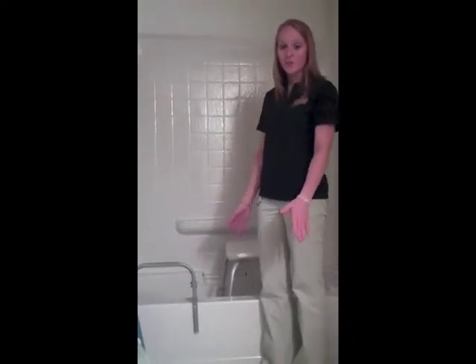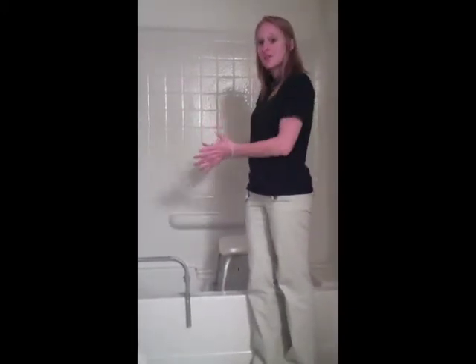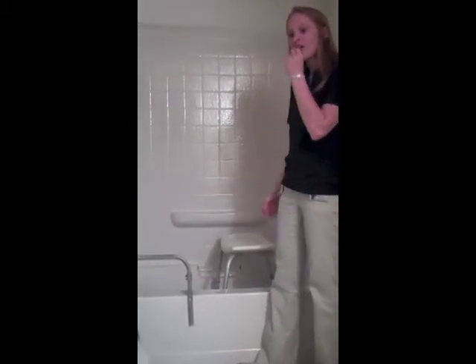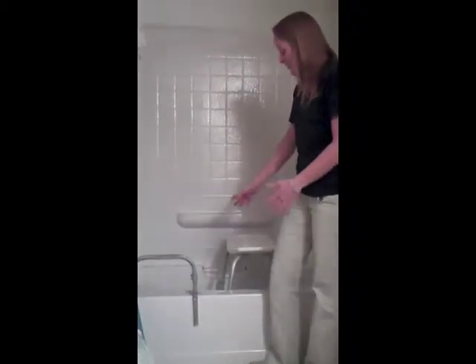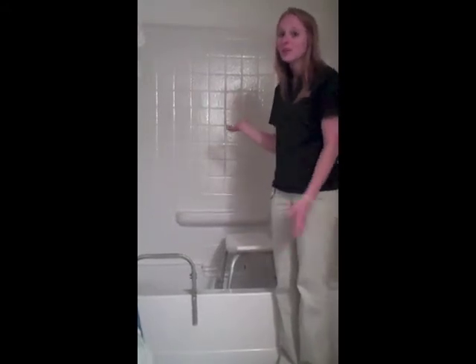Getting into and out of the bathtub can be very risky, especially when you have an injured lower extremity, and that is often when you need the use of adaptive equipment. Depending on the setup of your shower, depends on which side you get in on. For example, if your shower head is on this side, you'd want to get in facing your shower head. If it were to be on the opposite side, you'd want to get in the opposite way. You always want to be facing the shower head. Now that also depends on where you put your grab bars. Grab bars like this are detachable, which means they can be moved. If you have grab bars installed, you need to map that out ahead of time to make sure that they are installed in the correct places.